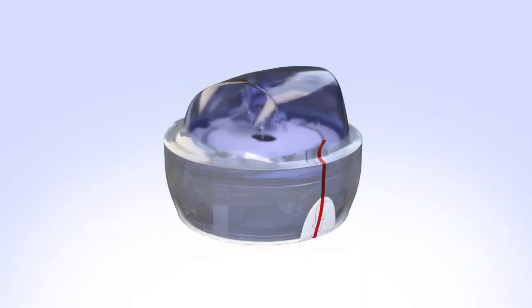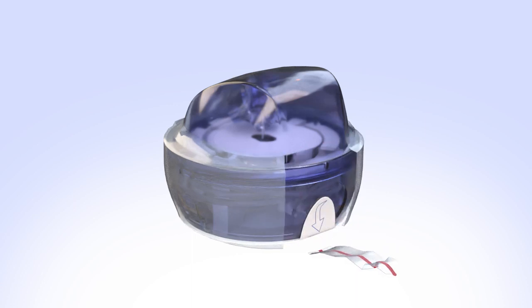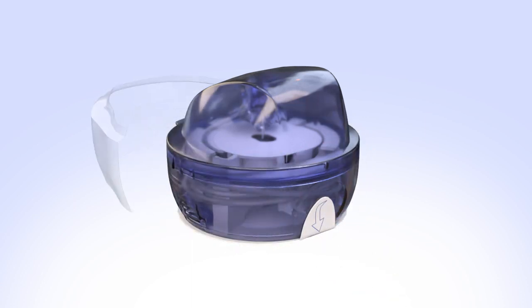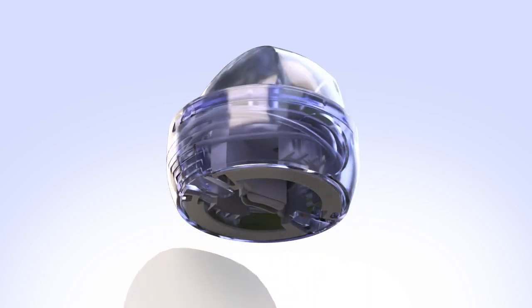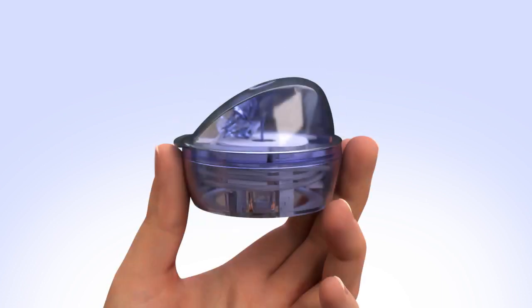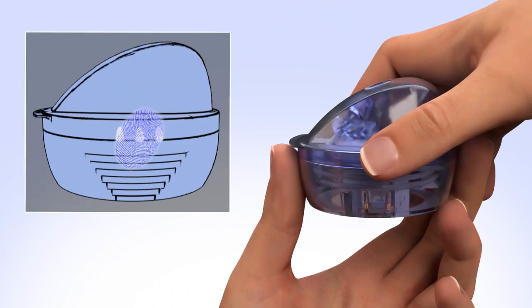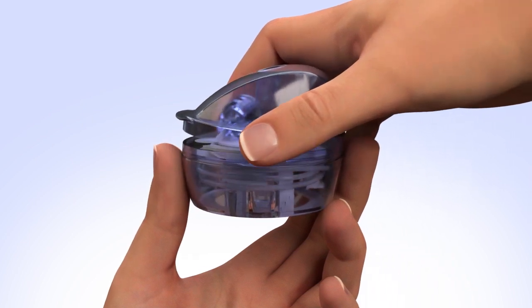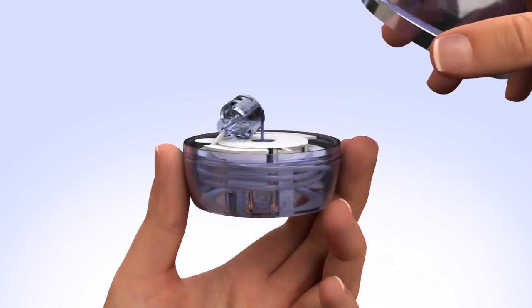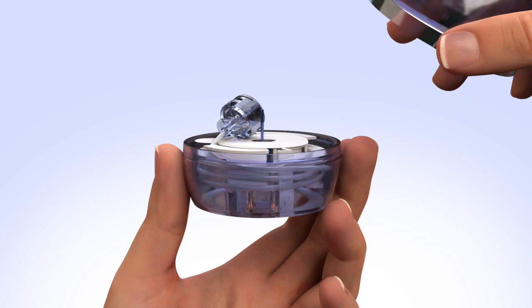To remove the MiniMed Mio infusion set from its packaging, pull the red tape and take off the protective seal. Pull down on the white tab and remove the sterile paper. With one hand, hold the bottom of the insertion device. With the other hand, hold the serter on the lined indentations located on each side of the device. Next, firmly squeeze and lift straight up to remove the lid, making sure not to bend or touch the introducer needle.